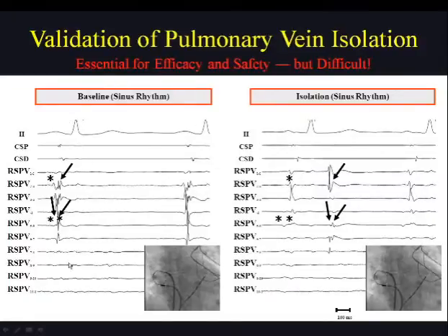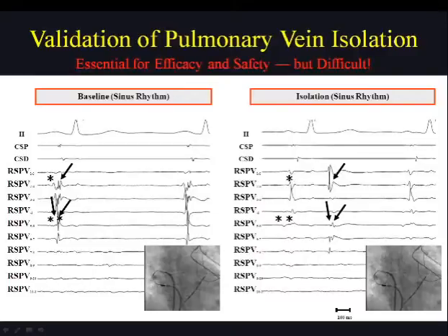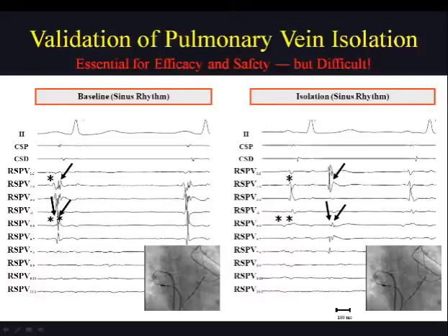On the left, you can see the potential before any ablation on the circular mapping catheter at the pulmonary vein ostium, showing an overlap of different potentials. On the right panel, I show the signals after obtaining a dissociated PV rhythm, confirming bidirectional isolation, which reveals that far field can be large amplitude and even double. On the other hand, the pulmonary vein sleeve potential is not always sharp and high amplitude — it can be tiny and fragmented. So a tiny potential can also be a PV potential.